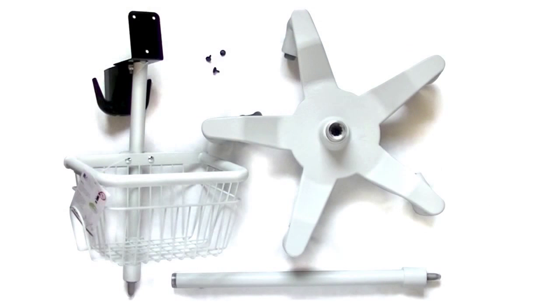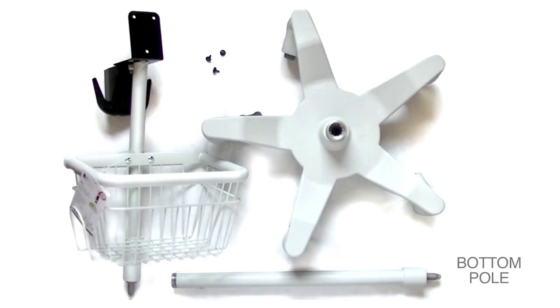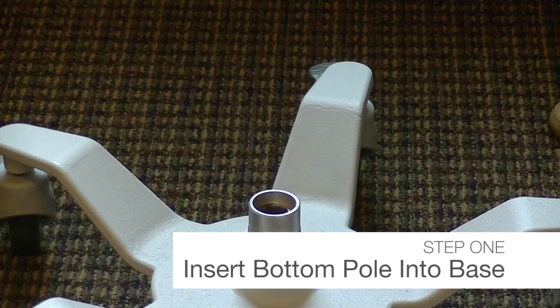Your 9000M-02 stand includes a pre-assembled caster base, a bottom pole, a top pole with basket, and screws. You do not need any tools to assemble the 9000M-02 stand.